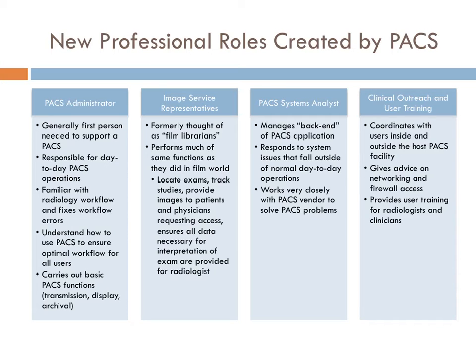The first is the most common, which is the PACS administrator, and the PACS admin is generally the first person needed to support a PACS in a system. So they are responsible for the day-to-day operations of PACS. They are the go-to person if you have a problem. They're familiar with the radiology workflow already, and if there are any PACS errors, they are able to fix the workflow errors that occur with PACS.